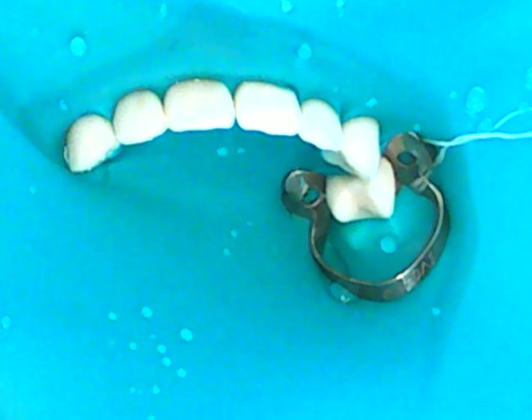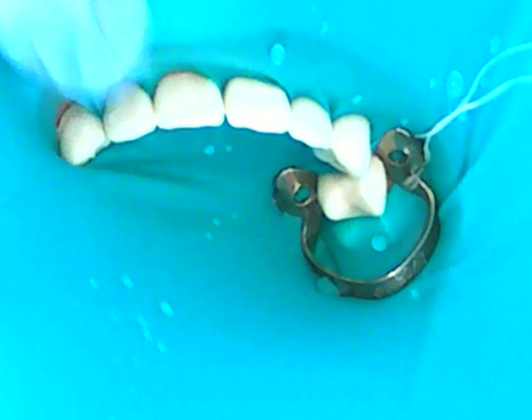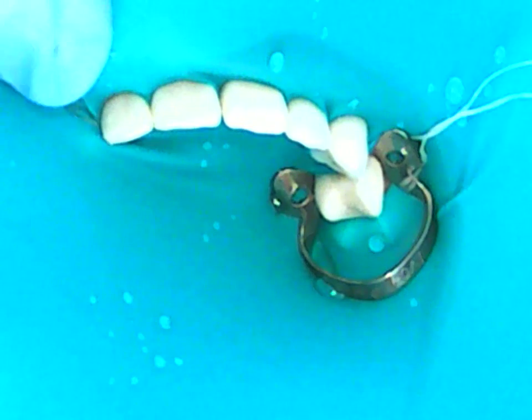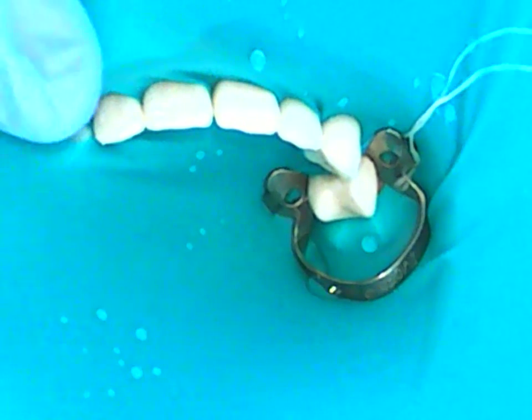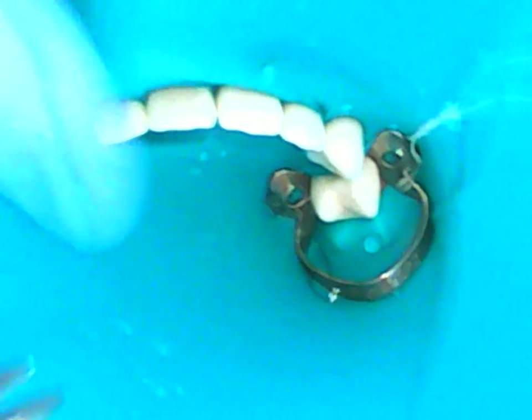If you can hold on to it with your fingers, you may just simply remove it with your fingers as well. Okay. Cutting the septa, scissors positioned horizontally while we stretch away each septum. So one hand, my index finger again on the lingual aspect of the dam, if you want to think about it that way, and my thumb on the facial. So one has already popped off, so that's okay.